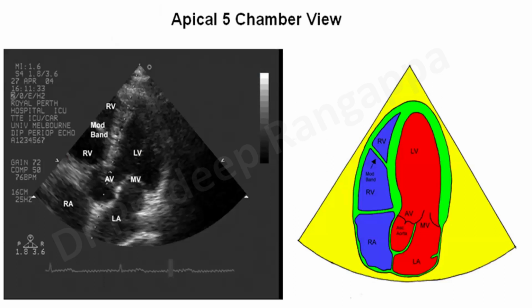So this is a five-chamber view where obviously many of you would be doing left ventricular outflow tract velocity time integral to calculate stroke volume. So for that you need this five-chamber because you would put the cursor with the sample at the LVOT and take the VTI measurement. And then you would do a PLR to see the VTI increase after you do a PLR to see the fluid responsiveness. So many of the intensivists would know that. So you need to do four-chamber, five-chamber, two-chamber, and three-chamber view.